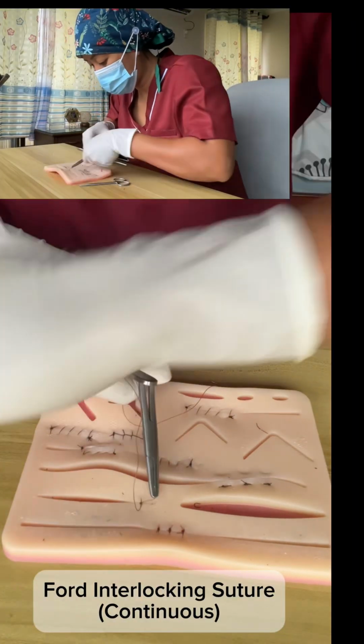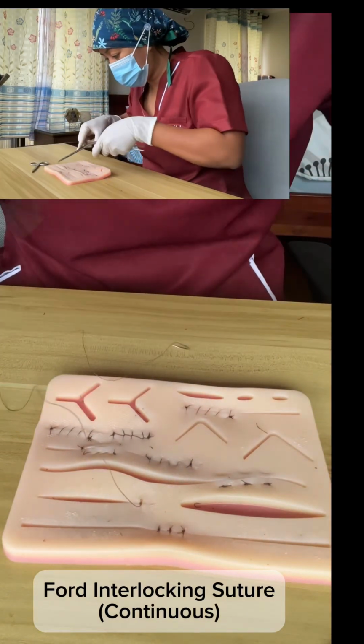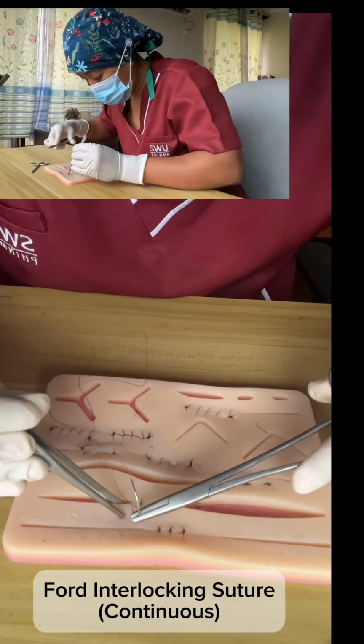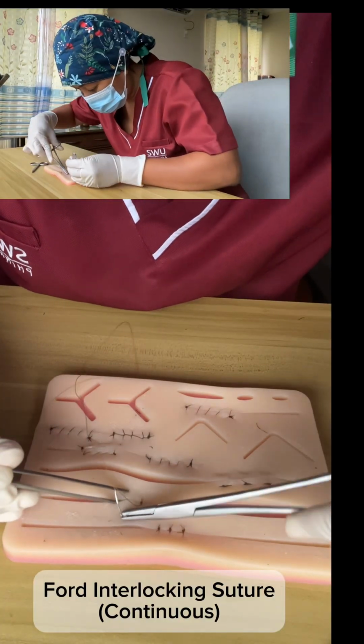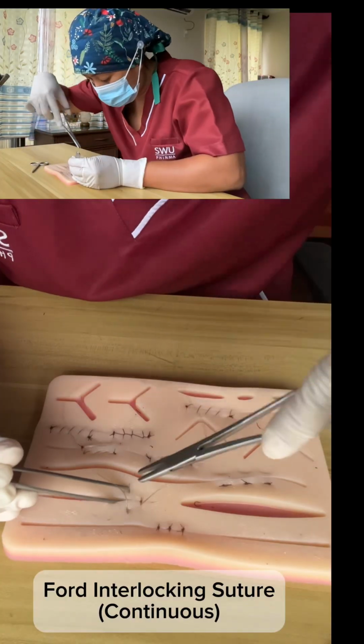The interlocking loops make it more secure than a simple continuous, preventing the whole suture from loosening if one part breaks. Lastly, it is useful in long incisions because it is quicker than placing many interrupted sutures.